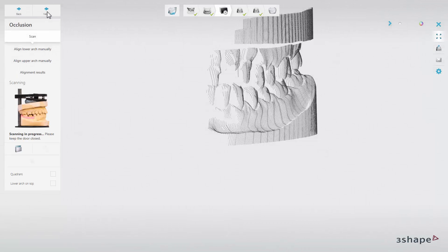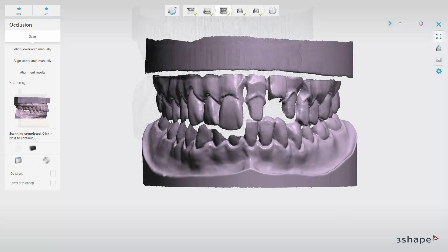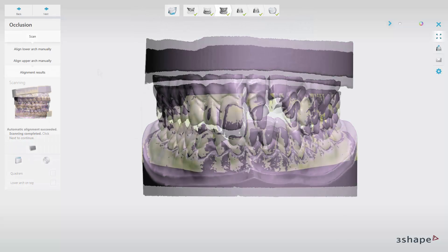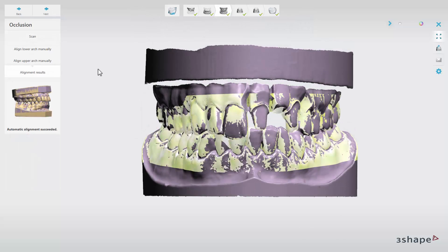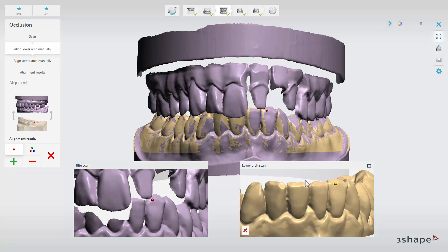Having the outcome of occlusion scanning ready, the software will always align it with the previous scans. Alignment results show the outcome of automatic alignment, but you have the possibility to align the scans manually using one or three-point alignment for each jaw scan.